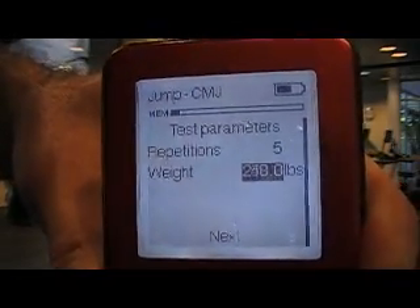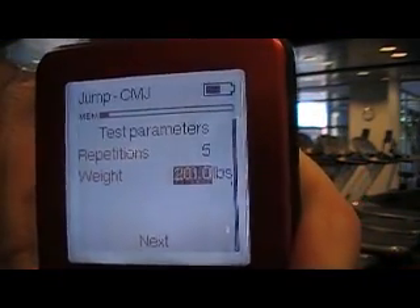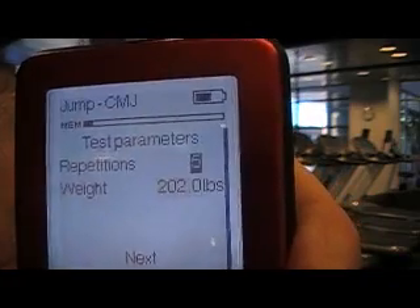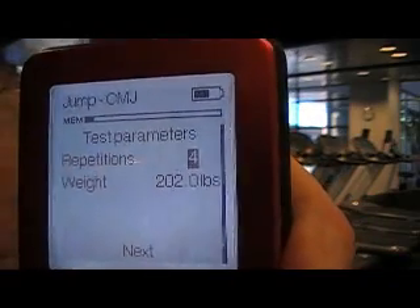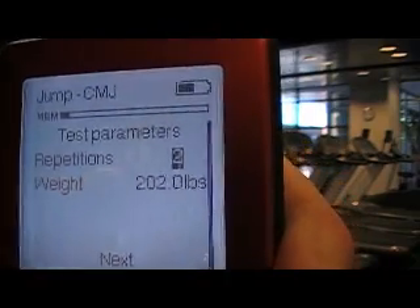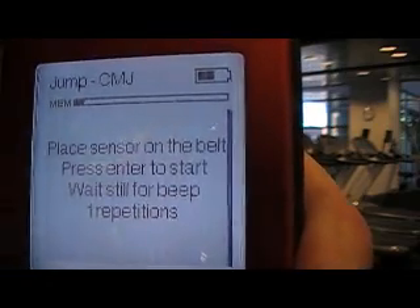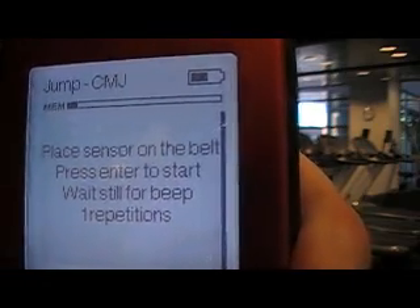I need to enter my body weight, which in this case is 202 pounds. I have an option of choosing repetitions anywhere from one to 20. For this example, I'll just do one. I go down to next, it says place sensor on the belt, press enter to start, wait for beep — one repetition.